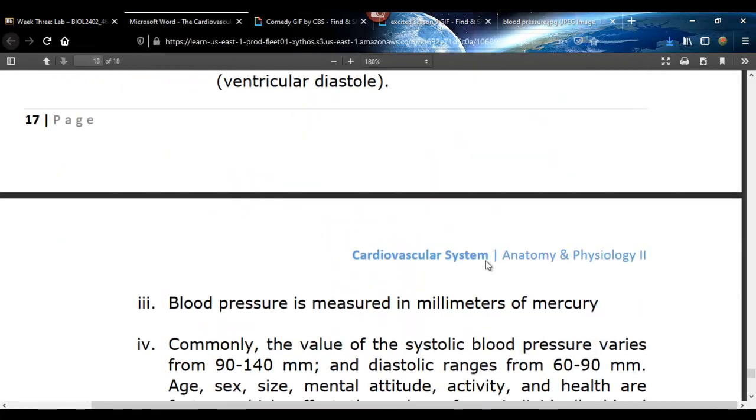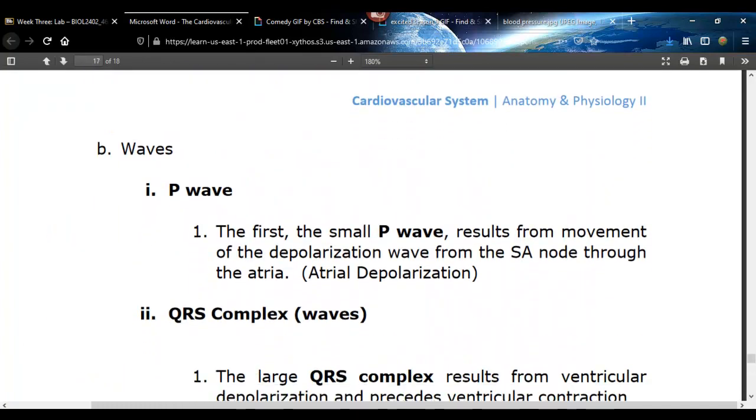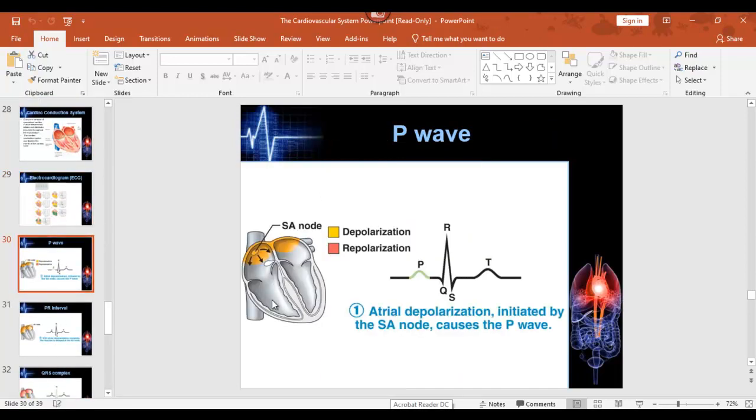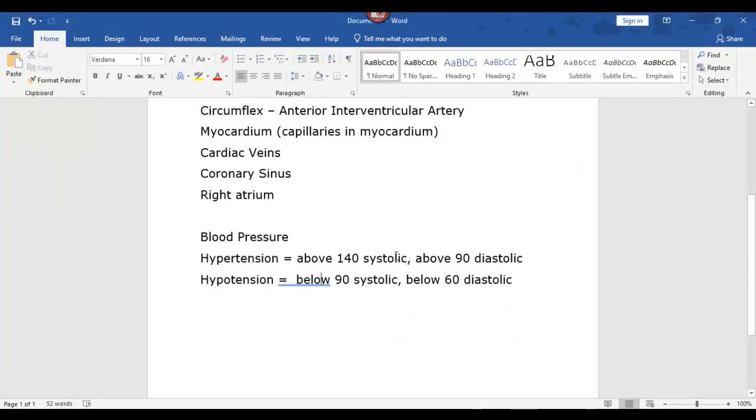Okay, so first things first. I thought I had a flat EKG. So, okay, well, here's one. These are all the waves. Here's a P wave. Here's a QRS complex. There are three waves within that, and then there's a T wave. That represents one heartbeat. So, what is a P wave?